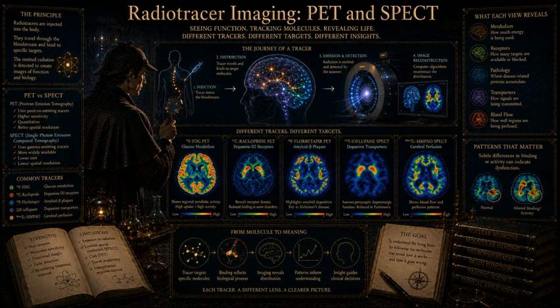In Compton scattering, the gamma photon strikes an electron in the patient's tissue. It transfers some of its kinetic energy to the electron, knocking the electron out of its orbit, and in doing so, the photon is deflected off its original path. It changes direction and loses energy. But the scanner only knows how to draw straight lines. If a photon is deflected, the scanner will draw a line based on its new trajectory, which means it will place the radioactive event in completely the wrong part of the brain.